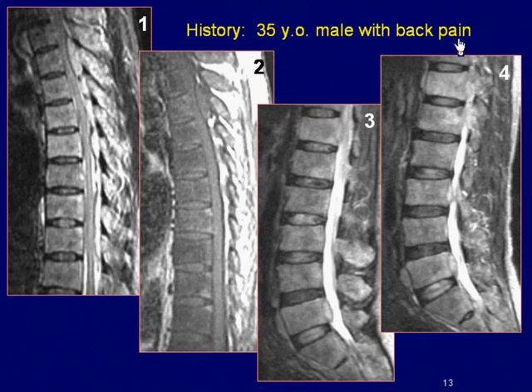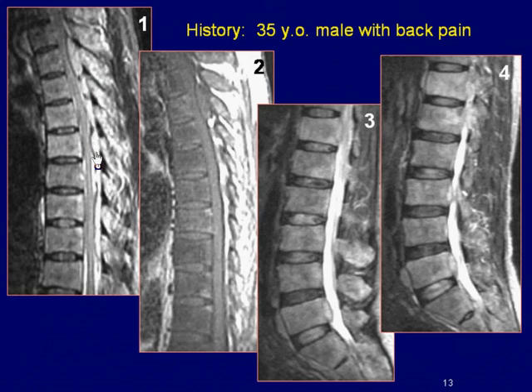A 35-year-old male with back pain. Sagittal T2-weighted image of the thoracic spine reveals heterogeneous high-signal lesions in multiple vertebral bodies, as well as a mass in the posterior epidural space.